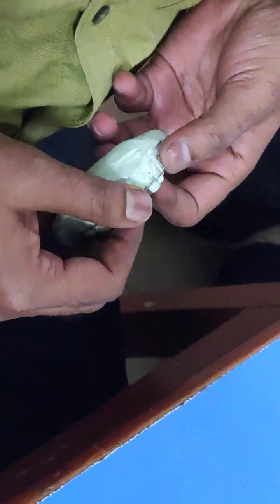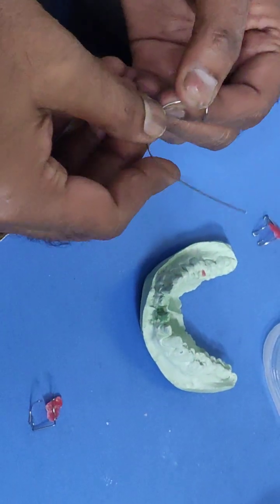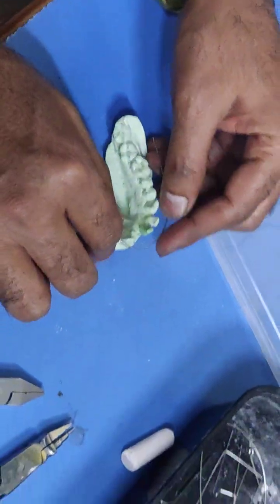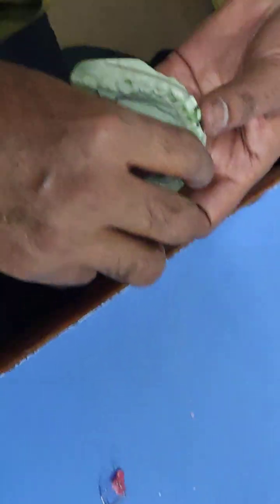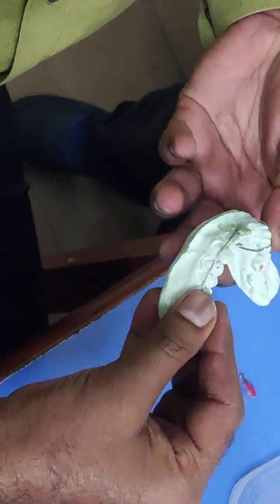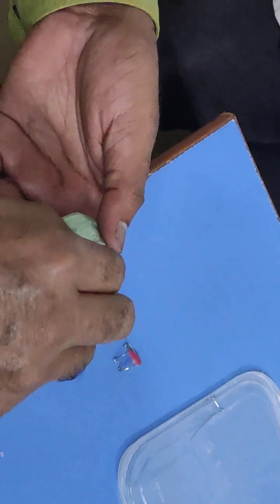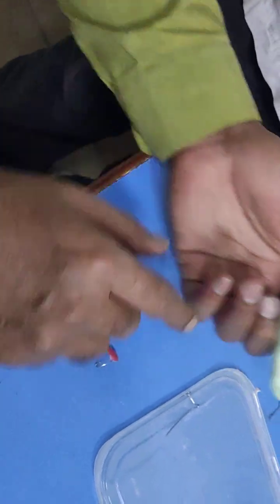Actually now it is not exactly in the middle, but it is at the junction of middle one third and incisional one third. That will also give the same result. Okay, either you place the curved section in the middle or at the junction of incisional one third and middle one third. Now the same applies for this side also. Keeping it first fixed on the opposite side, then only, according to the position of this crossover wire, you decide.